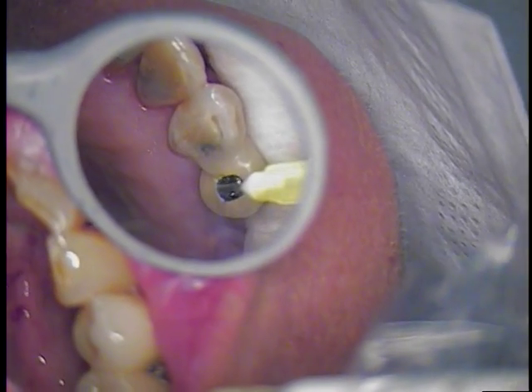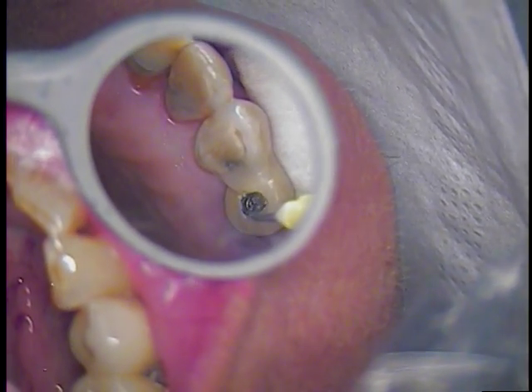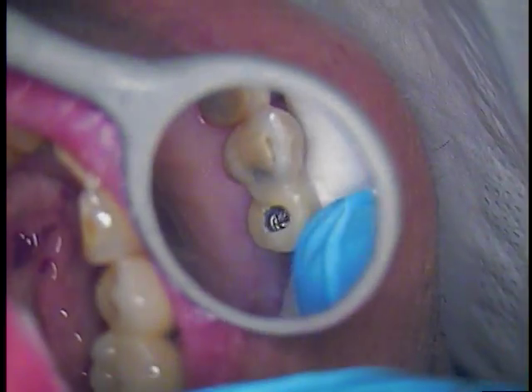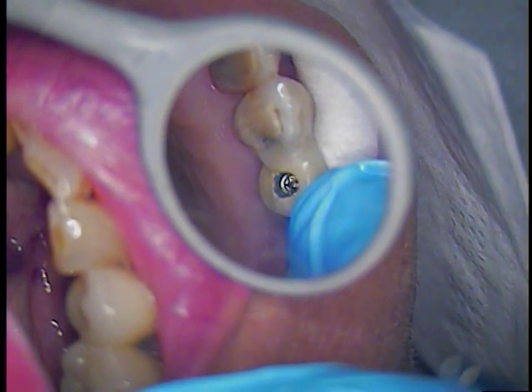We were able to use a driver. It looks like this type of screw head is... Can I ask for the next size up from this? We've got several things to use here, one of which is a Nobel driver, but it is a hex. And if I am looking with my scope, I see more of a configuration of a square.